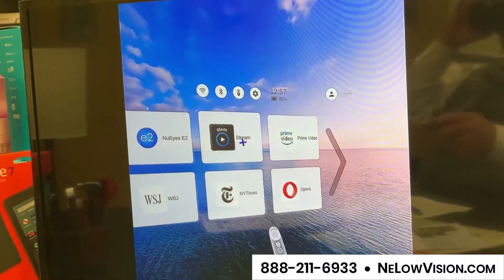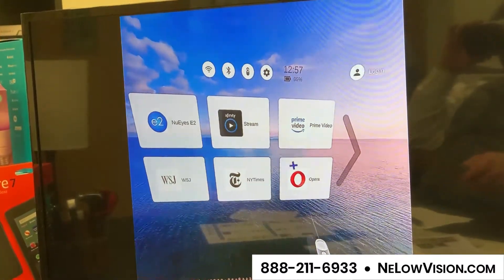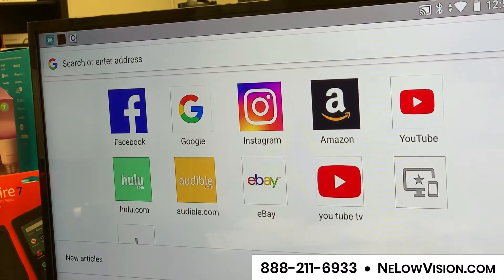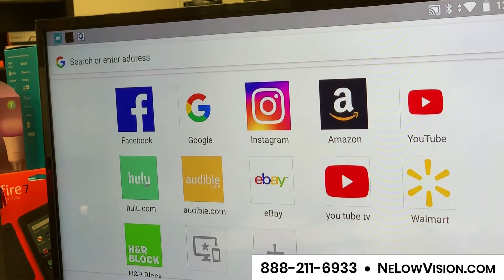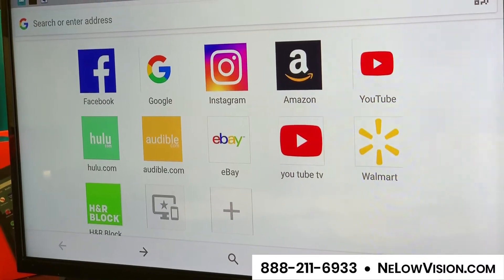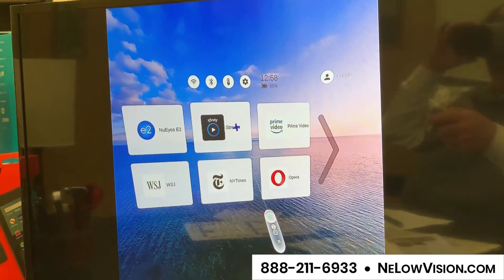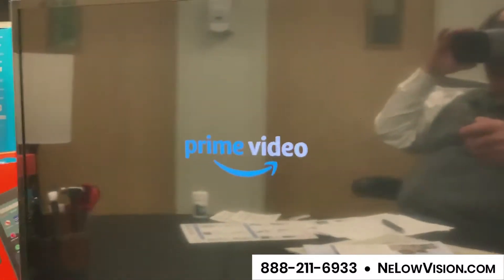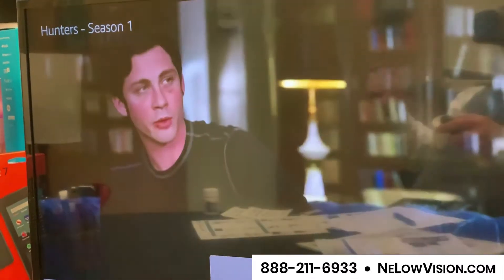Amazon Prime — you can stream that right to this device. You can read the New York Times and the Wall Street Journal. There's also Opera or Oprah. You can access Facebook, Google, Instagram, shop on Amazon, YouTube, YouTube TV, shop on Walmart — you have access to the internet on this wearable. I'm controlling what I'm seeing using this little hand wand or hand mouse. I'm going to go into Amazon Prime and select that now.